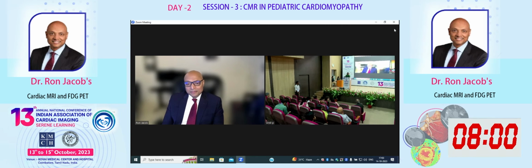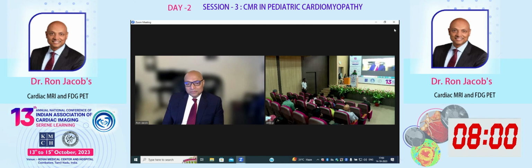But the way I look at it, the phantom just tells you nothing's changed. I agree with Vanessa 150%. You have to be militant with the vendors that they don't change anything. So there's this whole idea of accuracy versus reproducibility.